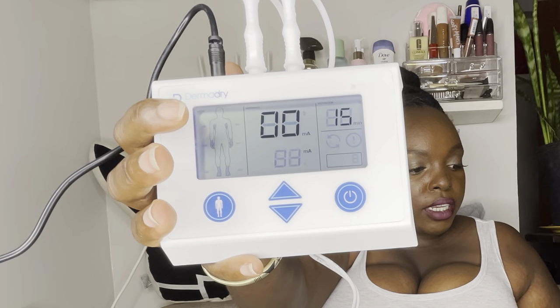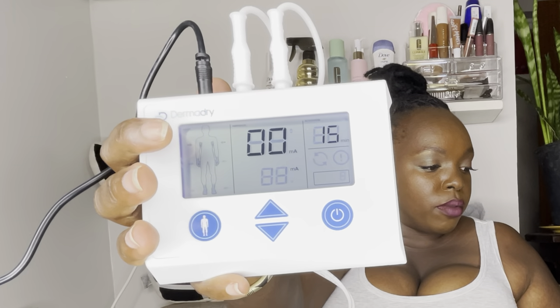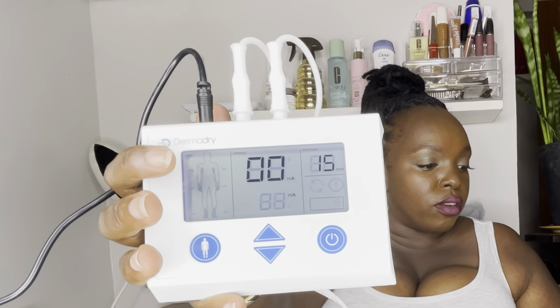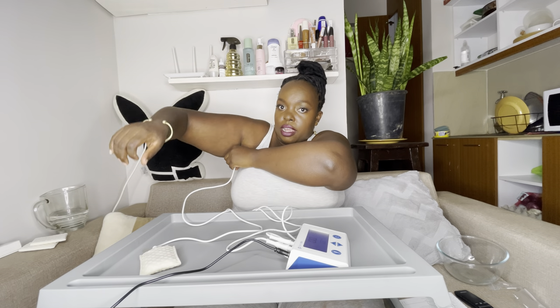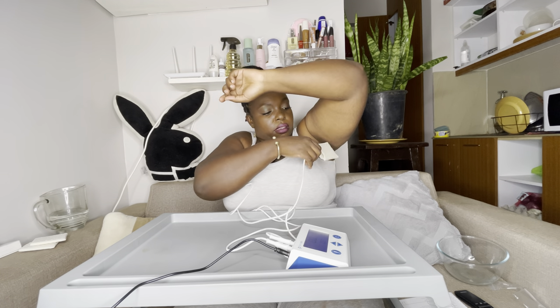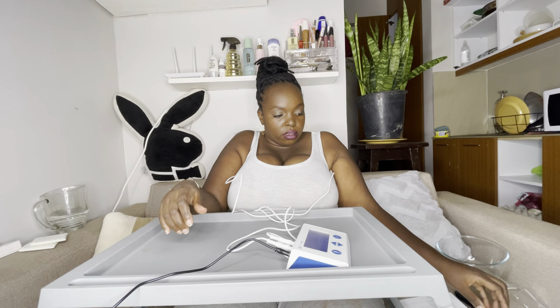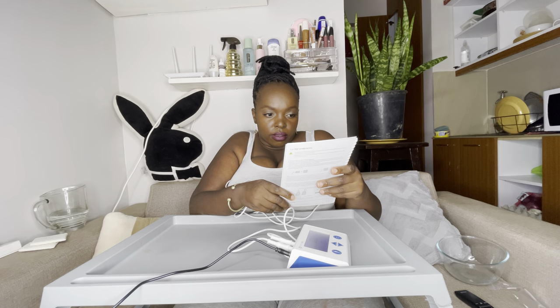In settings mode, the current setting point in mA and the profile will flash on the screen. For the first treatment, the current level must be set lower than intended. When the device detects that the user has applied the underarm electrodes, it will automatically switch to treatment mode and begin to deliver the treatment current.